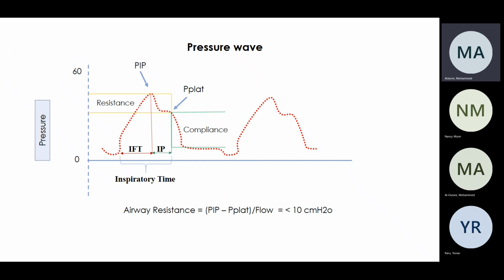So the flow in your machine, there's a flow per minute or a flow per second. When we look at the flow that we have in the machine, we divide it by 60 to get the actual flow. How can you make it easier for you, a very easy calculation? How can you get that flow out?